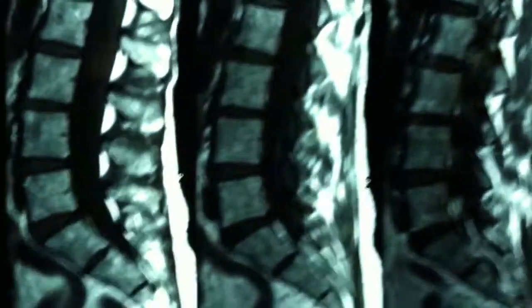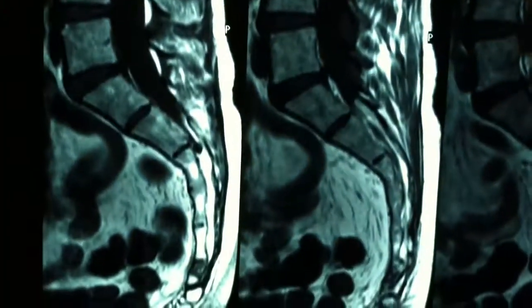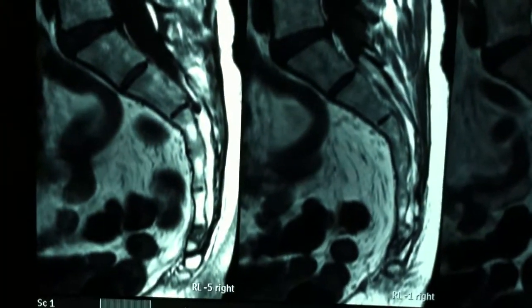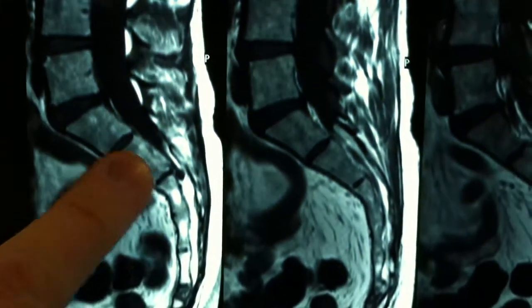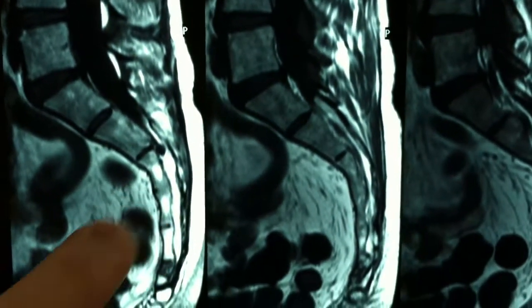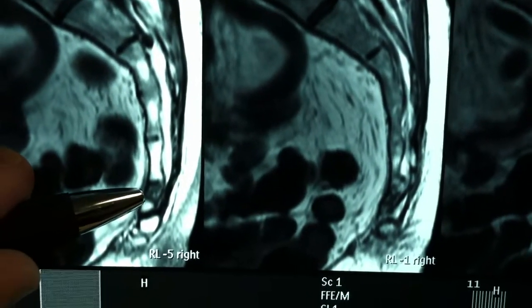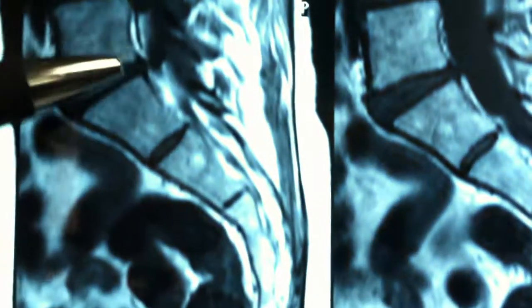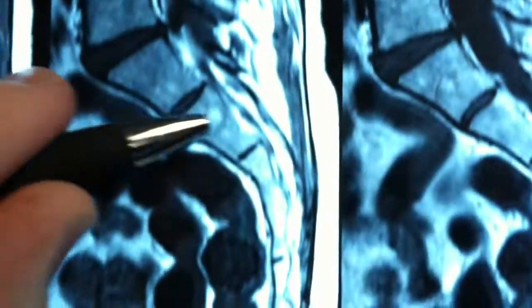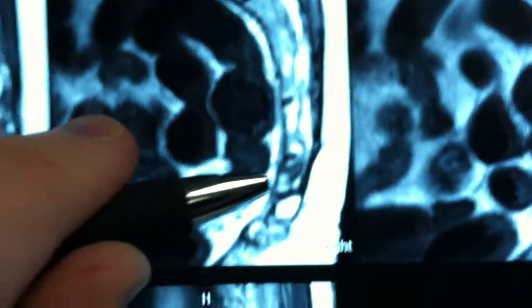If I swing over to the T1 images, fluid now shows up dark. And here you can see the bones of the lumbar spine down through the sacrum. And this right here — that's the upper or most superior bone of the coccyx. Again, lumbar spine, sacrum, and then upper bone of the coccyx.